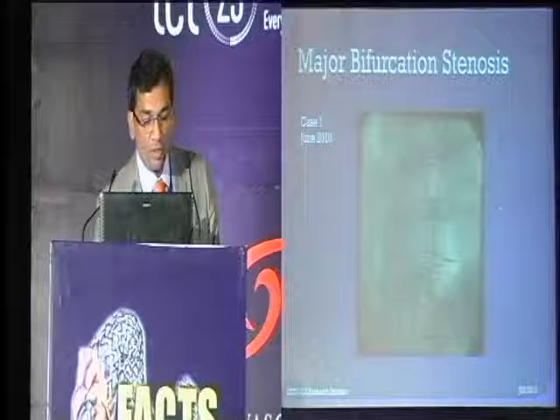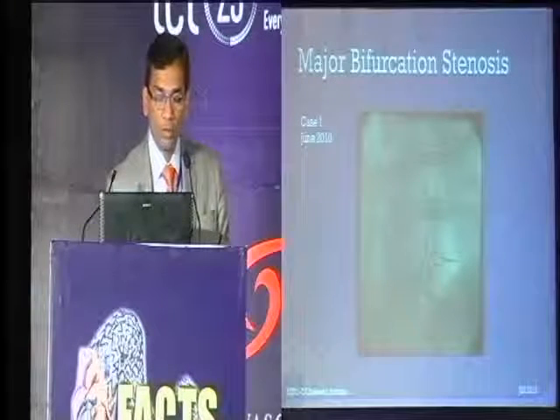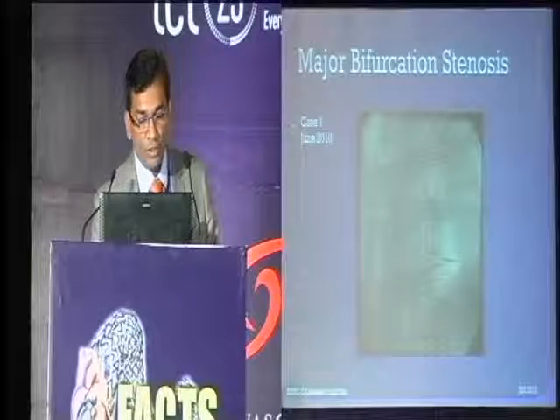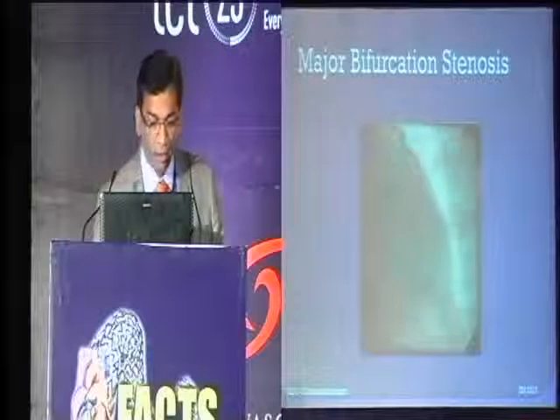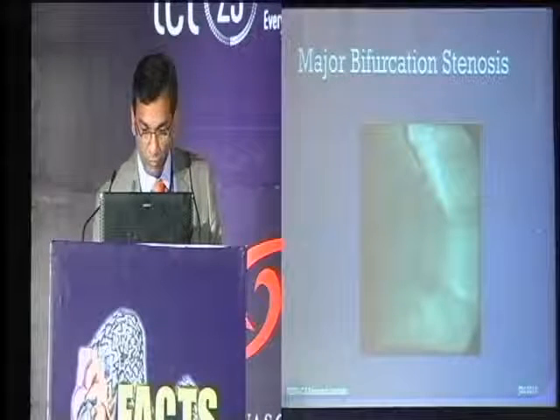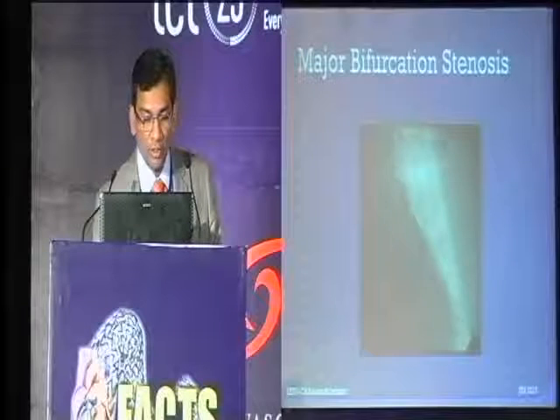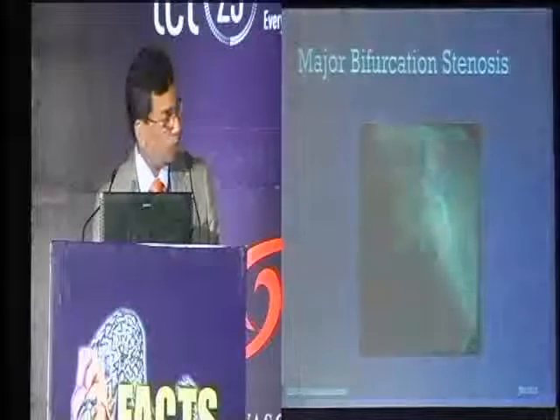This is a case of a 54-year-old female diabetic patient post-bypass surgery who presented with a non-transmural myocardial infarction. As you can see, a right coronary artery graft was previously placed.